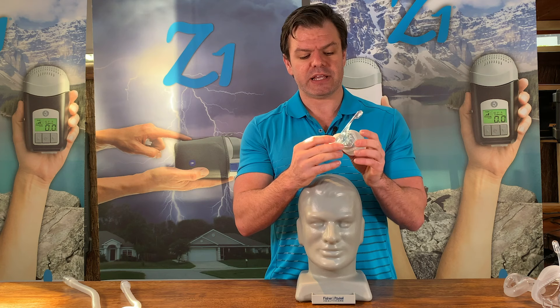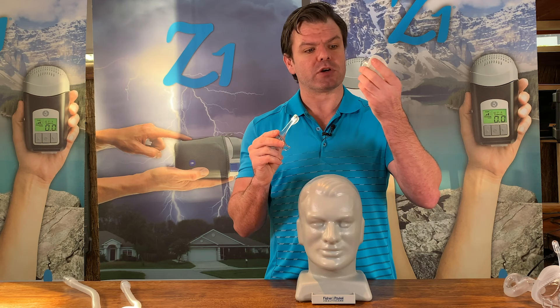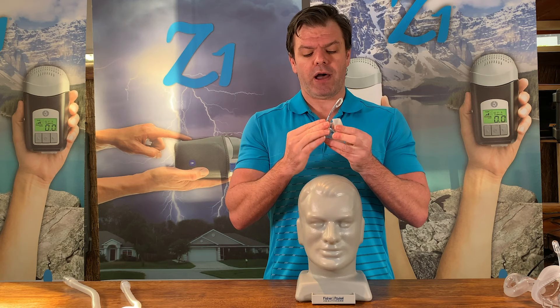This one here's an Eson 2. A lot of them now come in what they call a fit pack, which comes with this cushion part in a medium, small, large, and maybe a wide cushion as well. So you can buy them and then pick the right size for you.